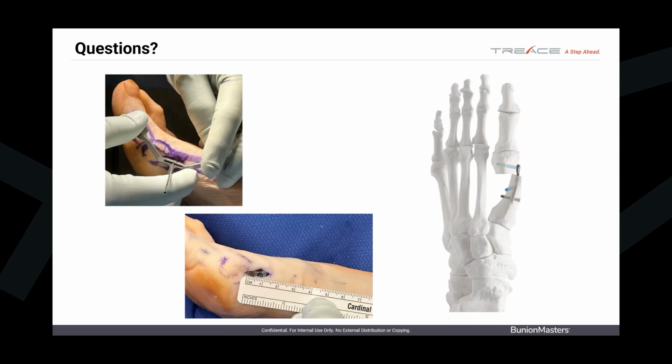So what we also find is that normally if a patient is type 2 in an arthritic condition, we're fusing that joint no matter what in the presence of a hallux valgus. But because we decompress by 2 millimeters, we're taking some pressure off that first MPJ, and patients can tolerate the hallux valgus correction without fusion much easier with an MIS procedure.